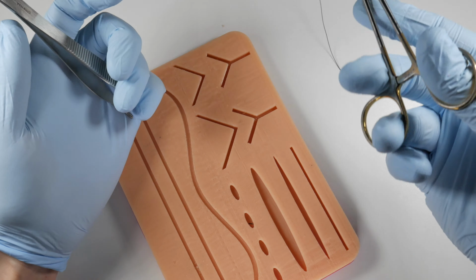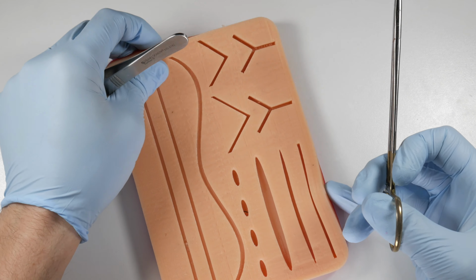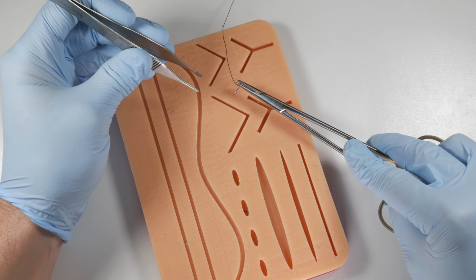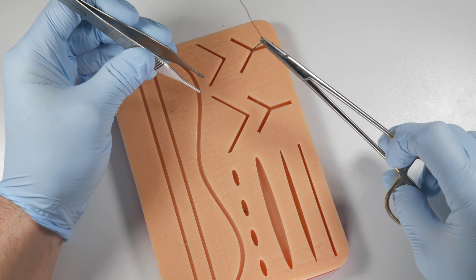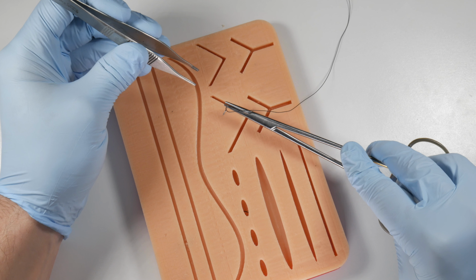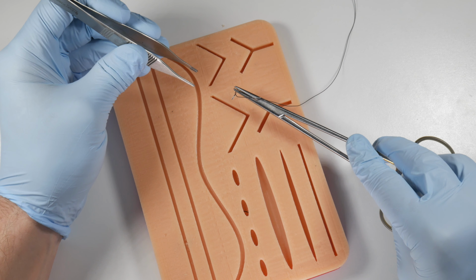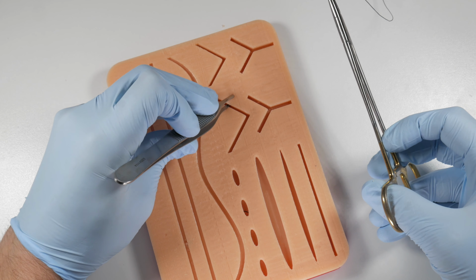Now, we're going to look at how to do this. So let's say that we're going to suture up over here with the vertical mattress suture. Now, what we're going to do with this is we're going to take a way wider bite initially than we normally would. So we're going to maybe go, say, 5 millimeters from the edge of the tissue versus, say, 2 or 3. And we're going to go out on the other side of the incision, maybe about 4 or 5 millimeters instead of just 2 or 3 millimeters. Once we're done that, we're going to come back closer to the incision on either side and tie our single knot over here.